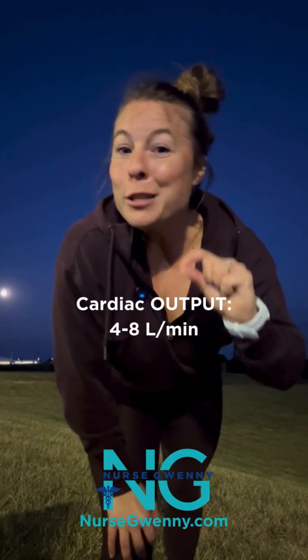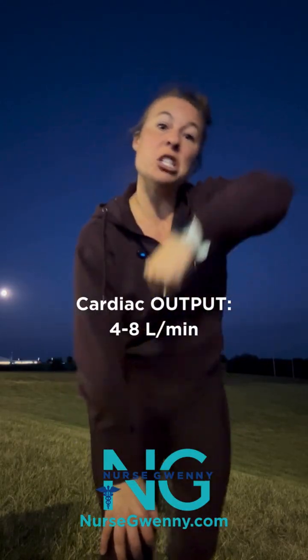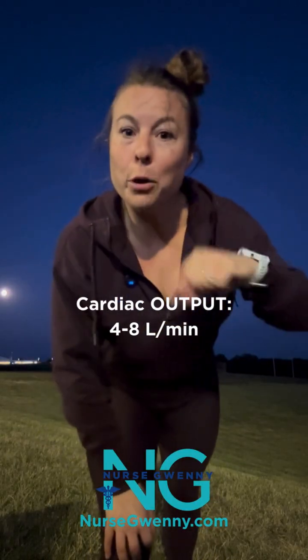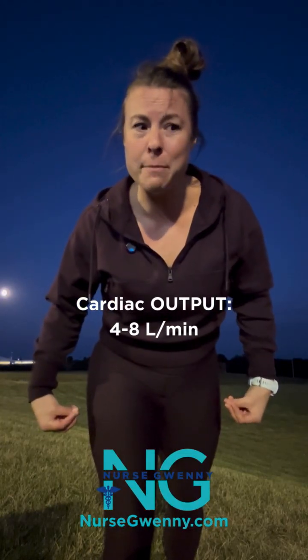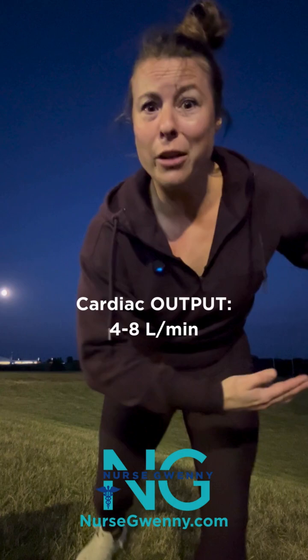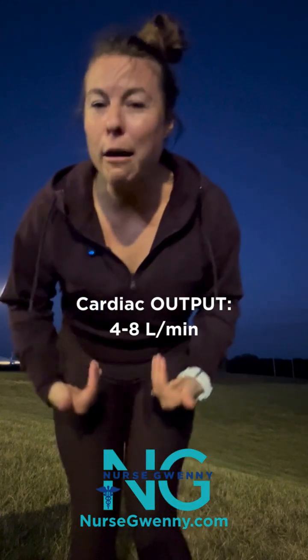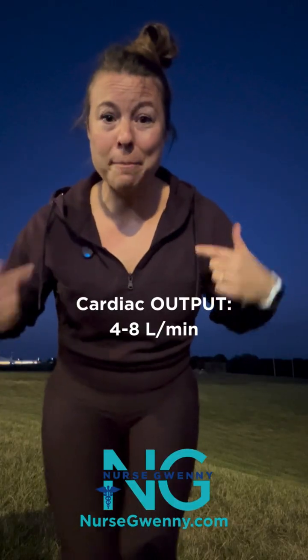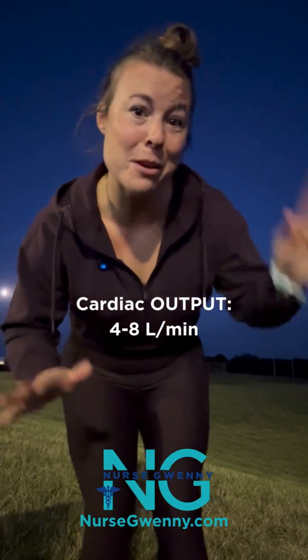Normal cardiac output is 4 to 8 liters per minute. That's the volume of blood that's being squirted out of the left side of the heart per minute. But think about me as a 5'5", 150-pound female versus Shaquille O'Neal. He's like 7 feet tall and 350 pounds. If I put out 4 liters a minute, it works for my frame. If he puts out 4 liters a minute, it is totally not enough to keep him perfused.